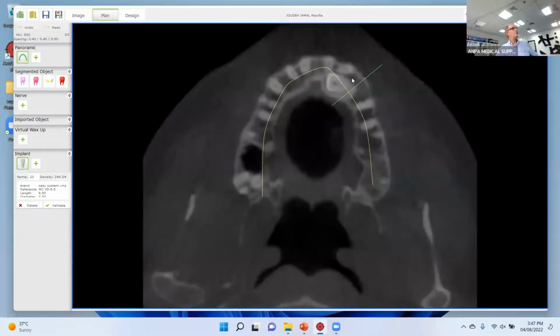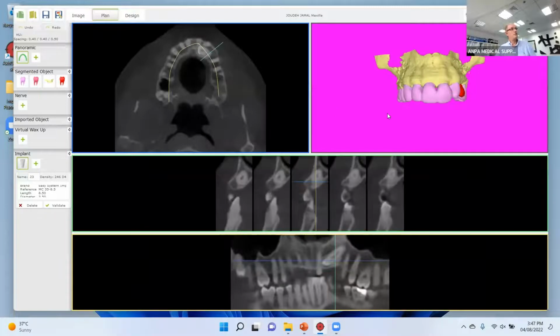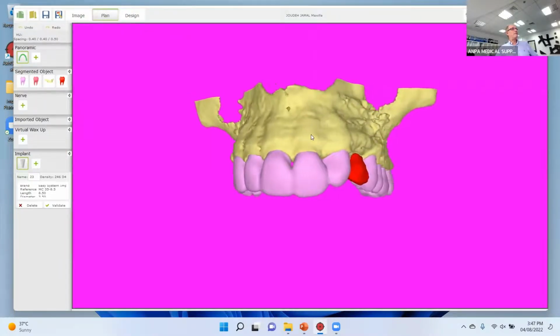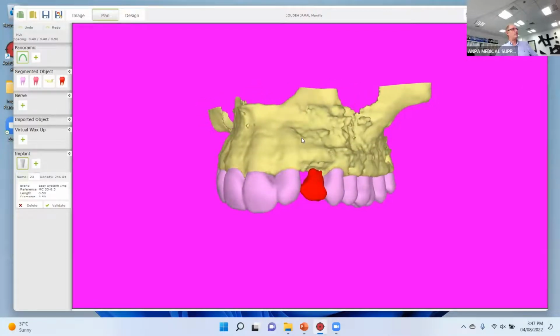But it's a big surgery, and in some cases it's not needed because the canine position is stable. The challenge is to say, okay, I have a canine here. Can I place an implant here to replace the missing baby tooth, which is going to fall? And this is not a matter of 10 millimeters. It's very, very limited and very accurate.